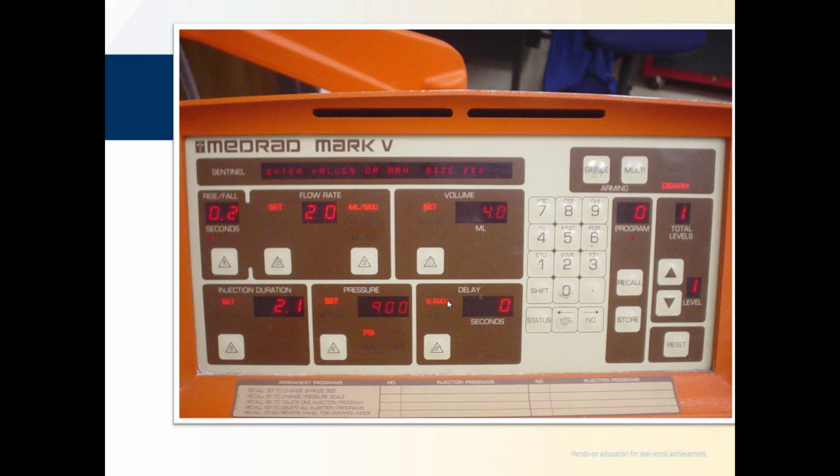And then you can have an X-ray delay or an injector delay for specific exams. A perfect example in CT is we'd have an X-ray delay and then set it at, I don't know, 10 seconds. And then after 10 seconds of injection, then it starts to image. When you get ready to arm this, you select single, and it's going to then ask up here, have you expelled all the air out of the system? And you go yes, and that will arm the unit.